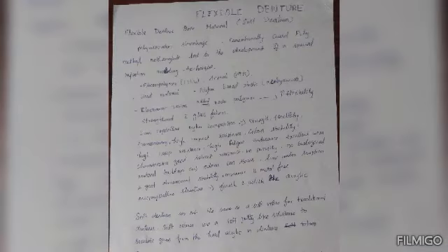Let's see about flexible denture. So this is flexible denture. Flexible denture based material is also called soft dentures. The polymerization shrinkage of conventionally cured polymethyl methacrylate led to the development of a special injection molding technique. So in flexible denture we are using a special injection molding technique.